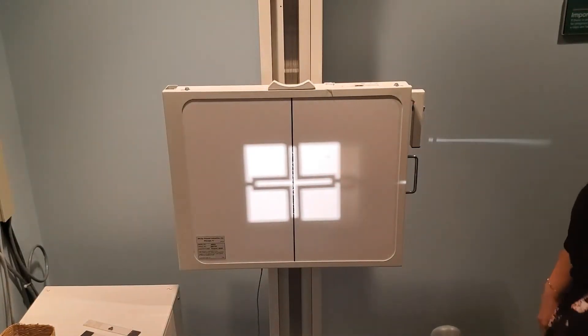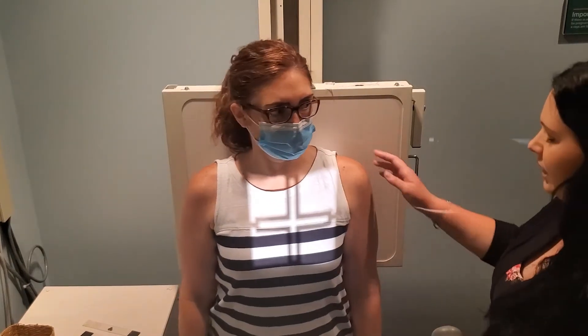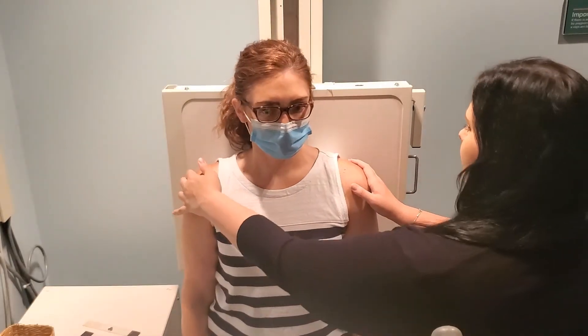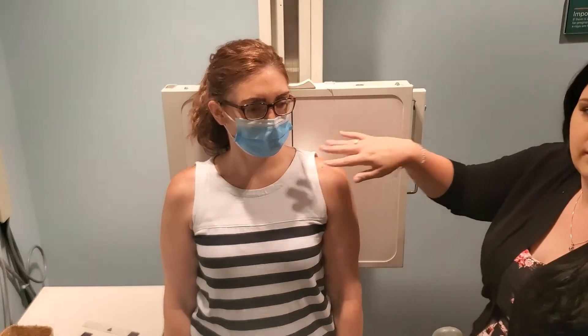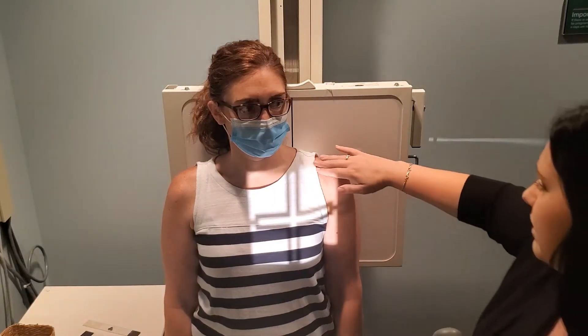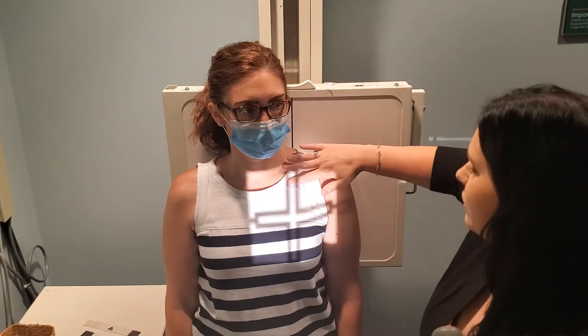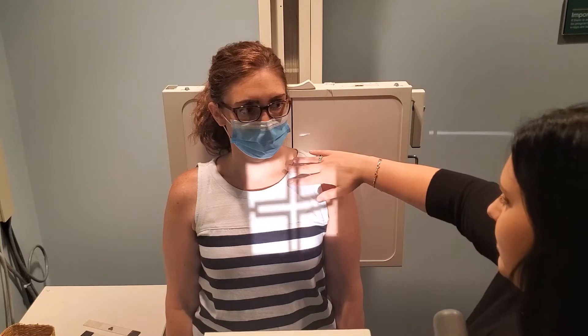Have the patient face toward the tube and off-center them slightly so that the middle of the clavicle is in the center of your cassette or exposure field. Your centering is just to mid-clavicle. If someone has a broken clavicle, do not palpate hard — just use light touches. That's all you should need for this image.